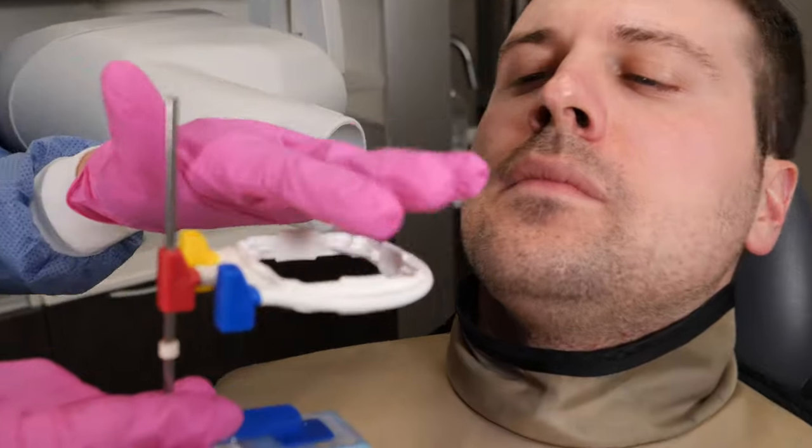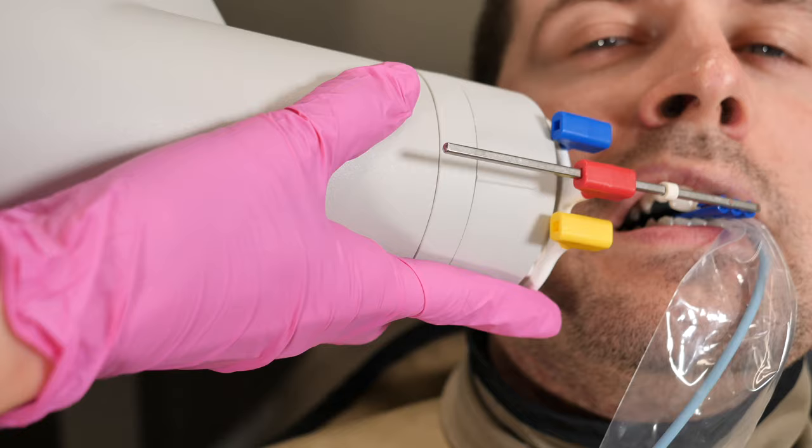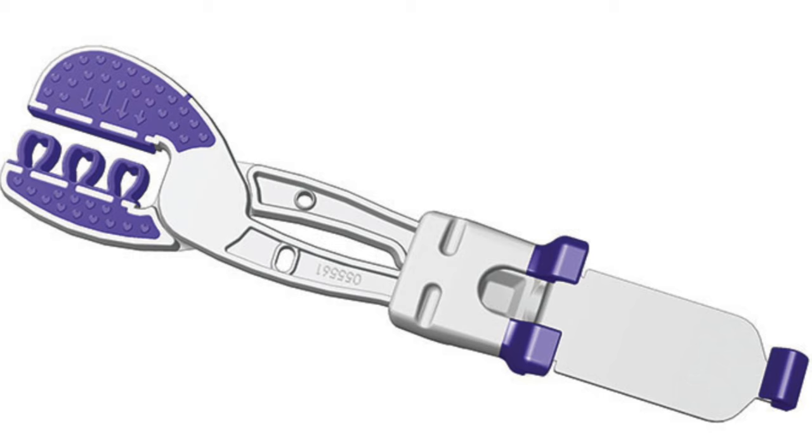The ring or XCP, in my opinion, for digital dental x-rays are only supposed to act as guides. They are not always great to perfectly line up with. You have to really think about what you're doing, and even sometimes pretending you're using a snap array — that thought process also helps me.